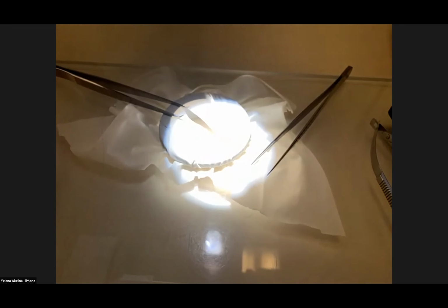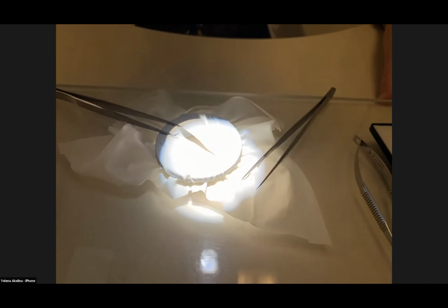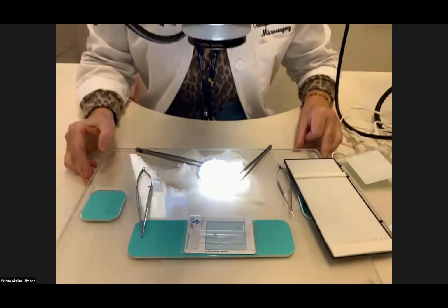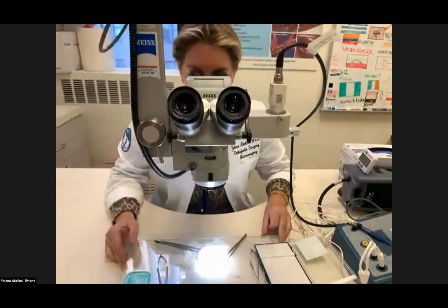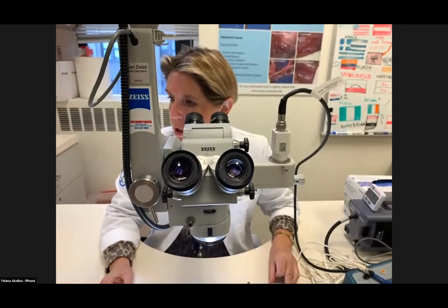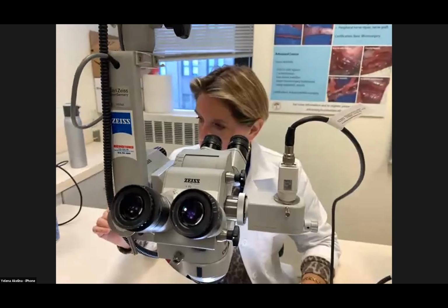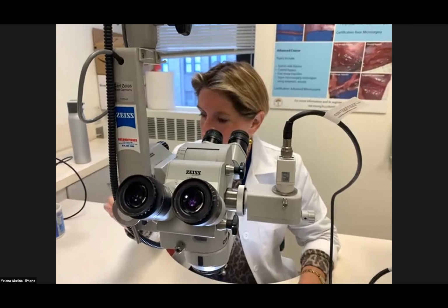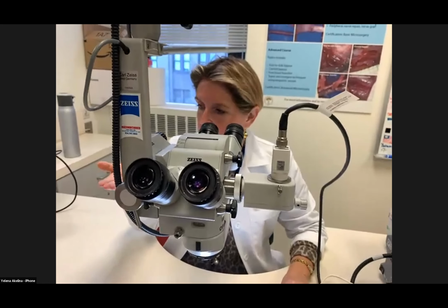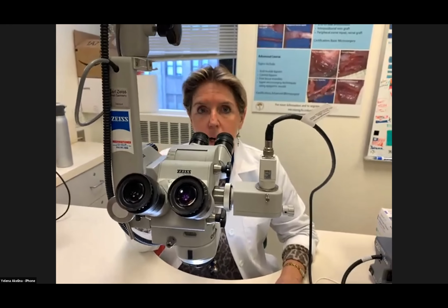So if you understand what it's called, parfocalization of the field. This is very important. You zoom all the way in on the highest magnification, adjust your focus, and then you can zoom out and you're still going to be focused. This is the number one rule of any microscope, no matter what you are using. Parfocalizing your view is number one: zoom all the way in on the highest magnification, and adjust your focus on the high mag.